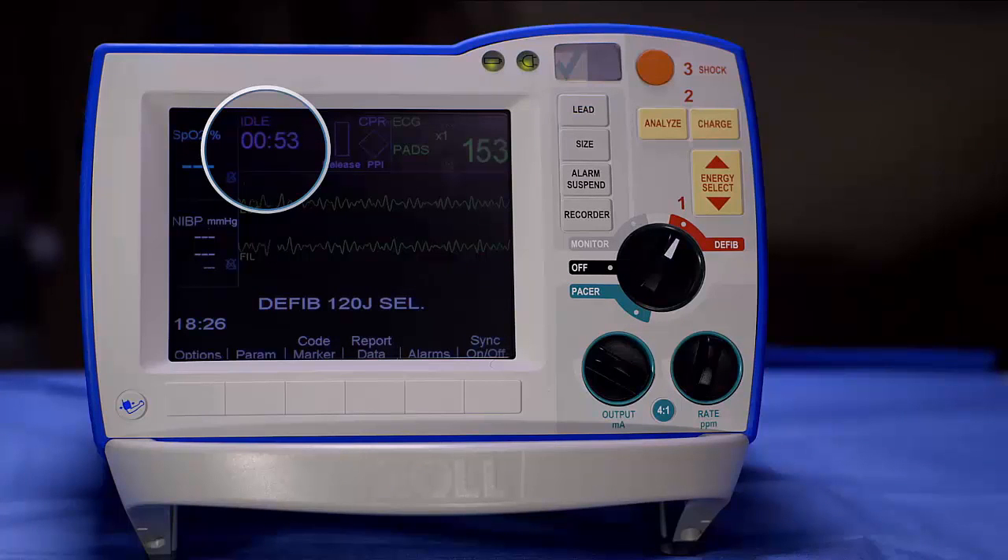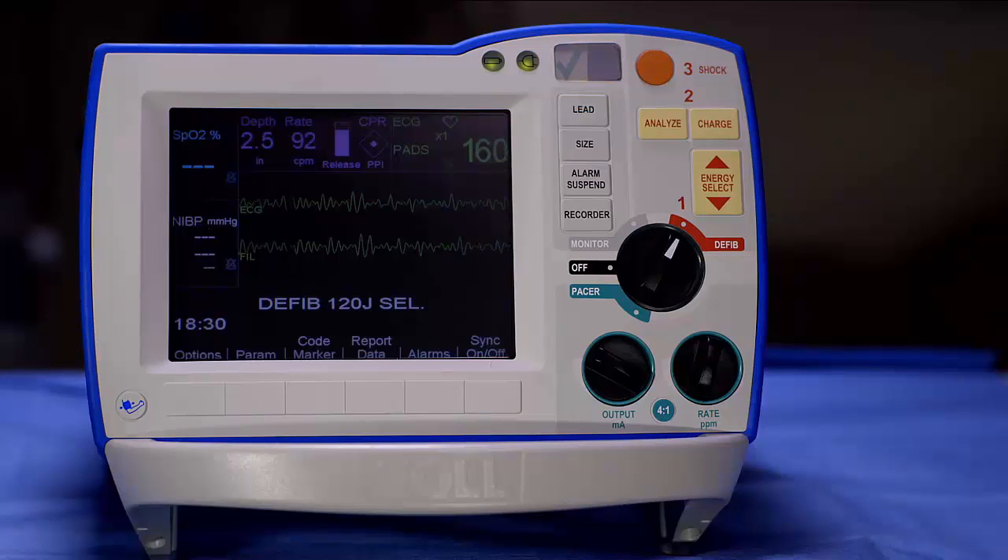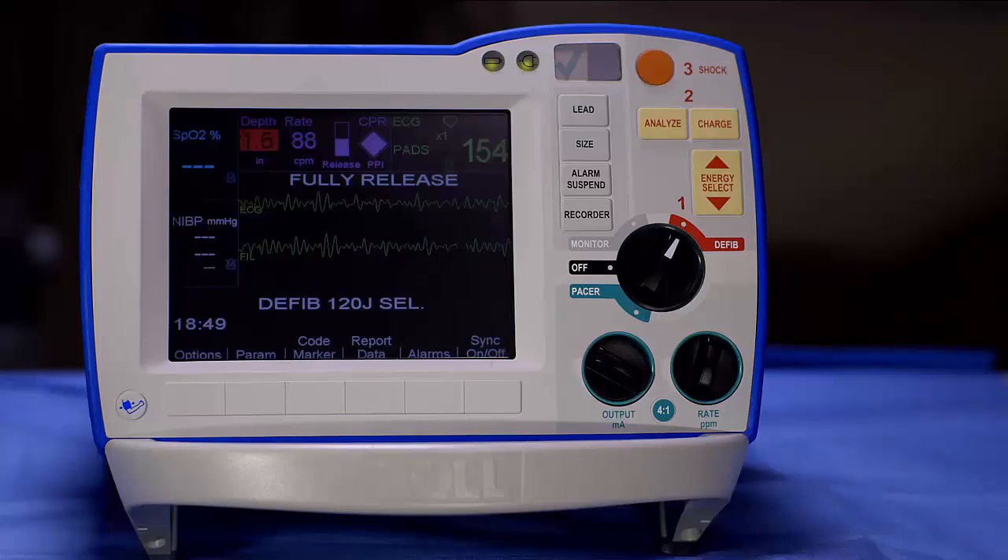The CPR dashboard on the R-Series defibrillator provides you with a digital reading of each and every chest compression. If your compression depth or rate falls outside of guidelines, the numerical value of rate and/or depth will turn red on the CPR dashboard. The R-Series defibrillator will also provide an audible message and a metronome will beep to help you reach 100 compressions per minute.